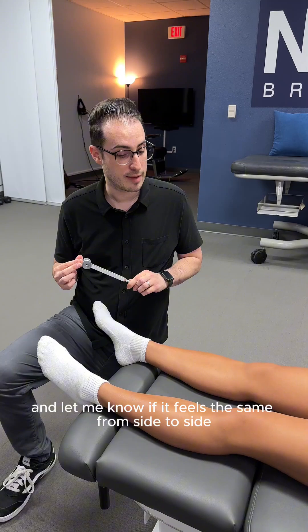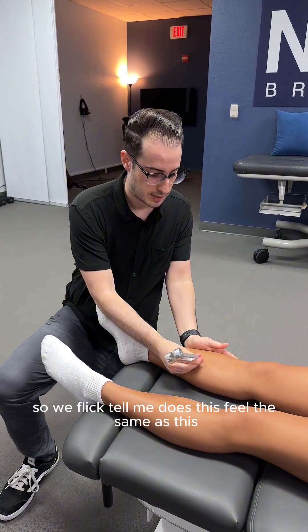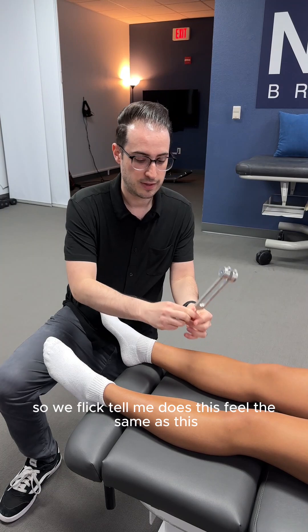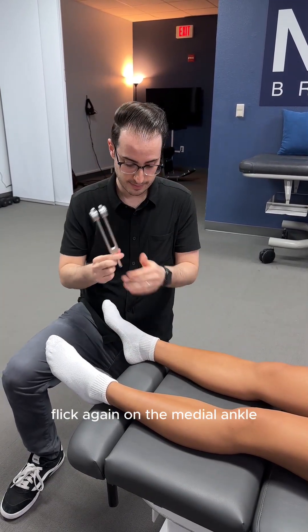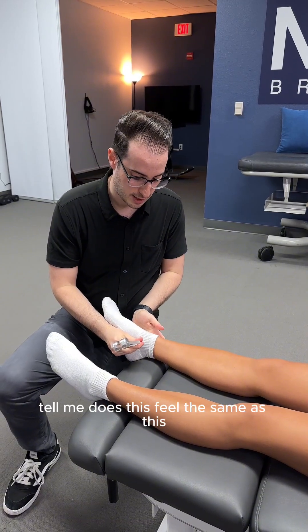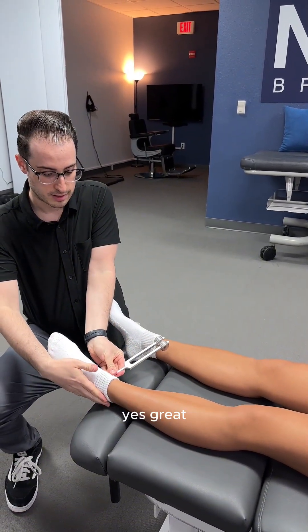Christelle, you're going to have your eyes closed and let me know if it feels the same from side to side. We flick — does this feel the same as this? Yes. Great. I'm going to do it again. Flick again on the medial ankle — does this feel the same as this? Yes. Great.